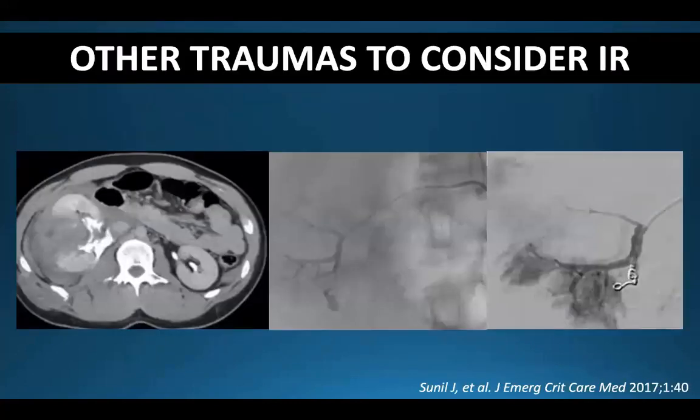In this case, it's pelvic trauma and trauma to the calyces with extravasation of urine in the collecting system. This is a delayed phase, as you can see the contrast in the collecting system. On angiogram, we have a catheter in the proximal renal artery with a microcatheter deployed selecting a right lower pole branch that shows the area of active extravasation that was successfully embolized. And then you see a little bit of contrast that looks a little shaggy in that right image. That's just parenchymal opacification.